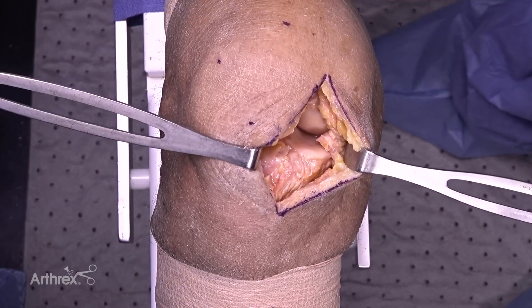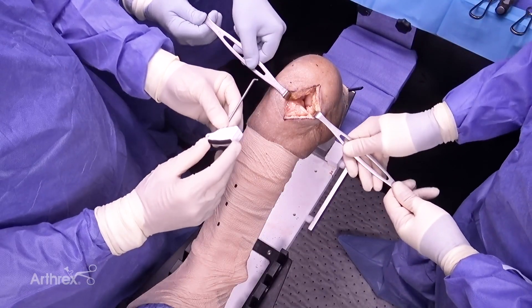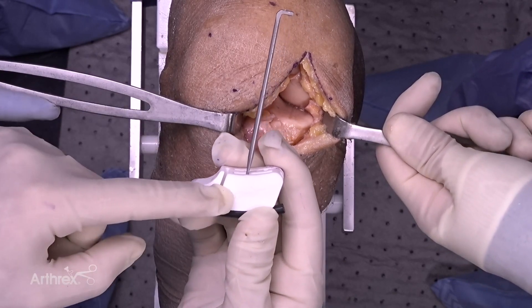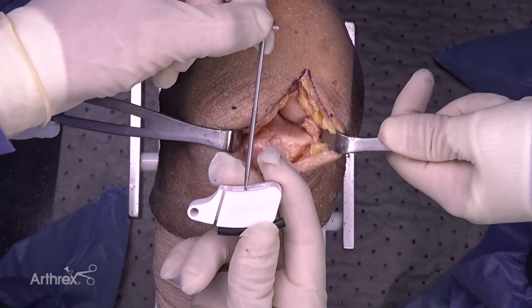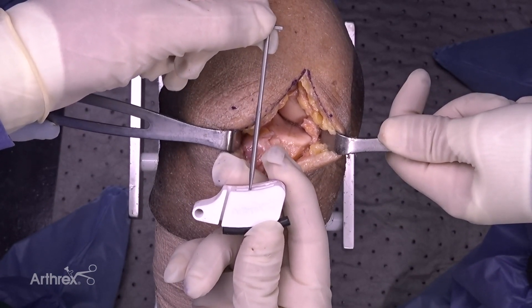We have very nice exposure of our joint. We now take the disposable tibial cutting guide — it's a two-part guide. We've got the guide itself as well as the stylus that will help set our depth of resection and slope, matching that to the patient-specific anatomy.